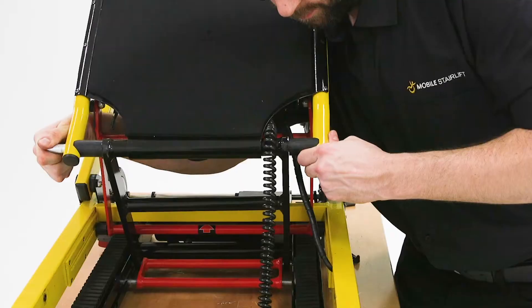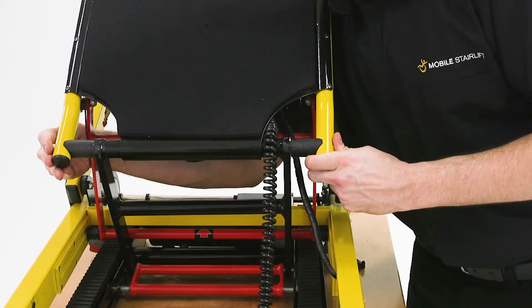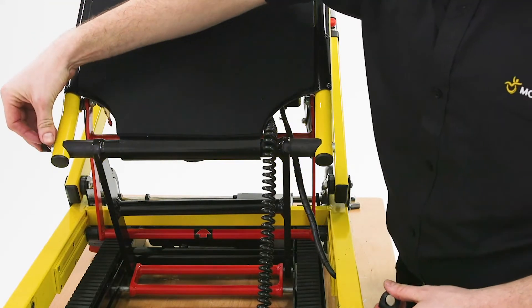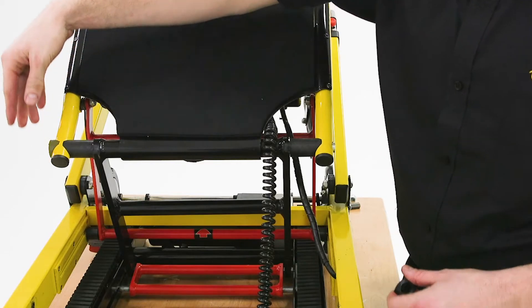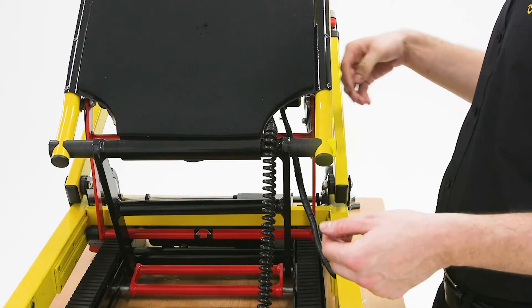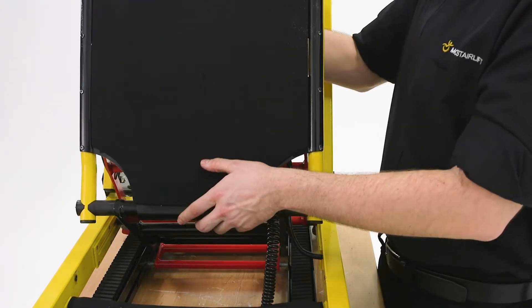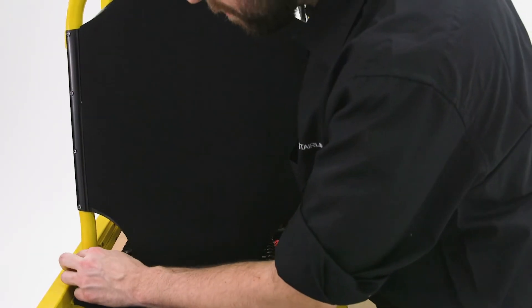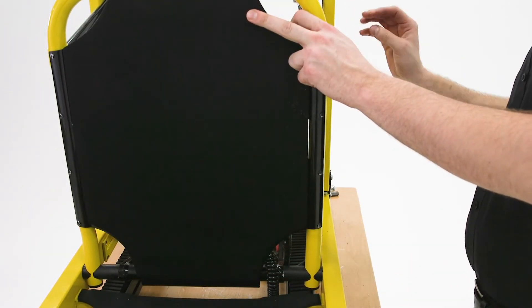Push the axle through until it is centered in the housing, while taking care to thread it through the black rubber washers. The larger rubber washers fit between the black hinged arm and the side of the seat frame, and the smaller rubber washers go on either end of the axle between the seat frame and the main upright frame of the stairlift. Once you have replaced the axle and washers, fold the seat until it is at a 90 degree angle to the main frame of the stairlift and the holes in the end of the axle are lined up with the holes in the side of the stairlift's frame.